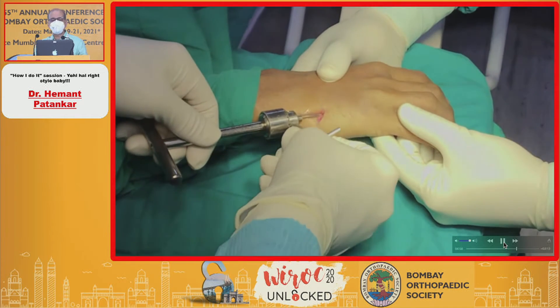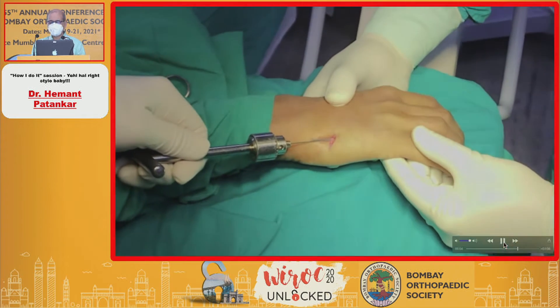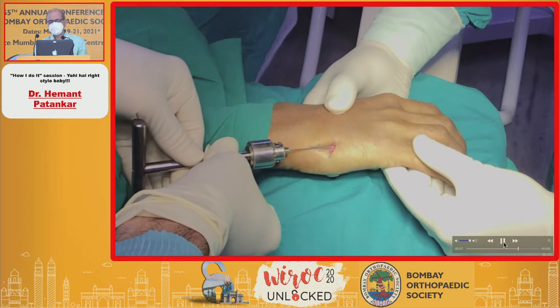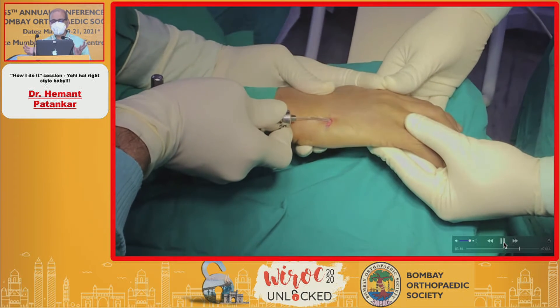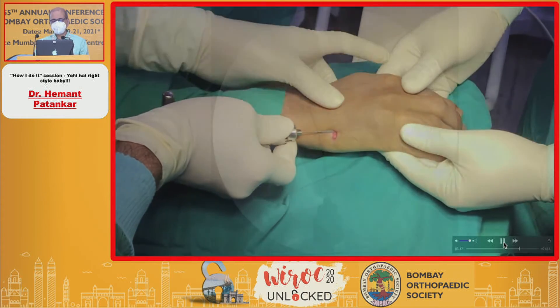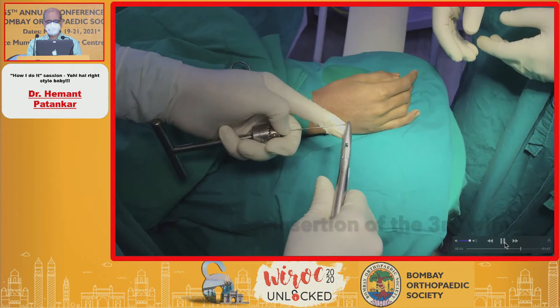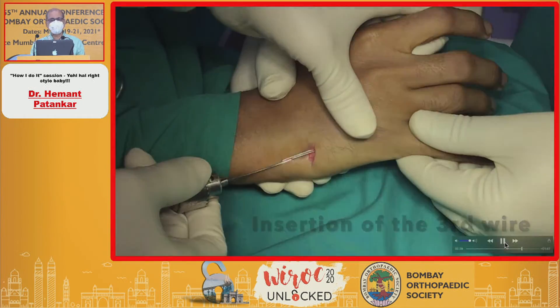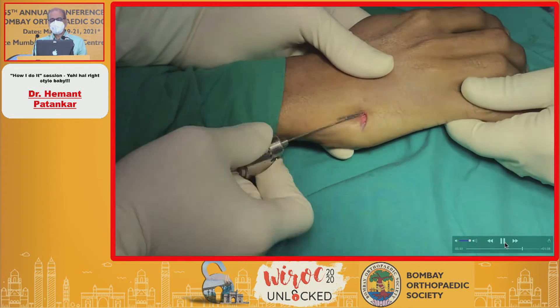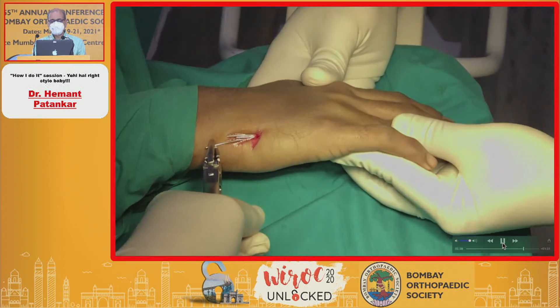Try to get a bouquet effect — try to see that the end of this K-wire is opposite the end of the previous one, as I will show on the C-arm. It is rotated to your satisfaction. See that the K-wire supports the maximum quadrants of the metacarpal head. The fifth metacarpal has a very wide intramedullary canal; up to five K-wires can be inserted. With a T-handle, you can insert three wires definitely very easily.